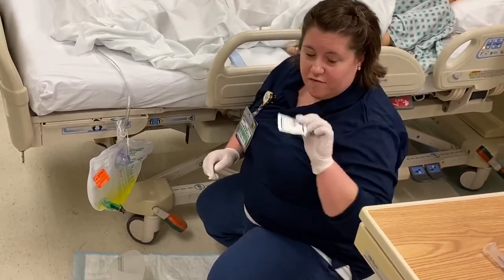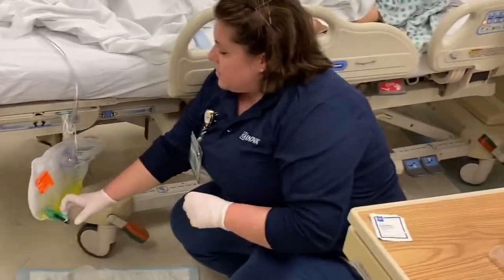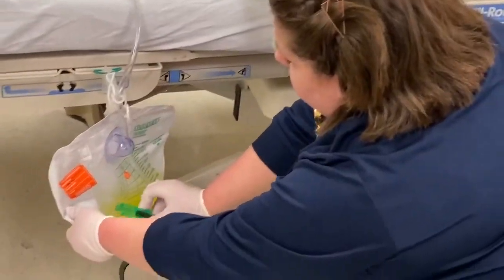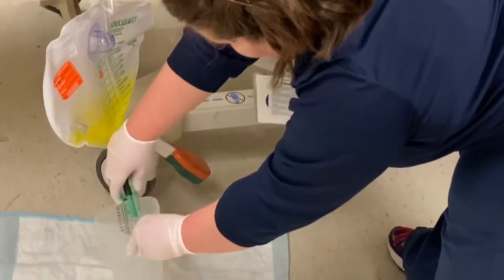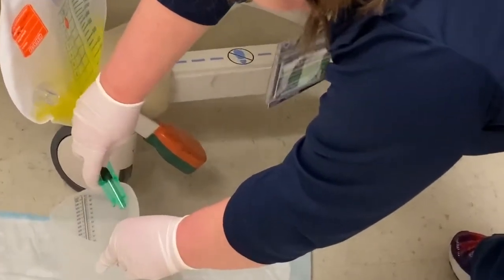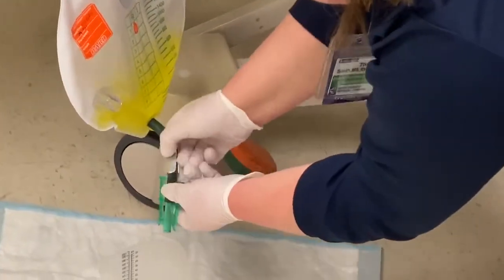And what I'm gonna do, I have my alcohol close by, but I'm gonna set that down on my table, is first, I'm going to unclip these green arms from the catheter bag. And then I'm going to aim my green spout right here into the canister. And the last thing I'm gonna do is unclip this silver clamp. So I want you guys to be able to see that.